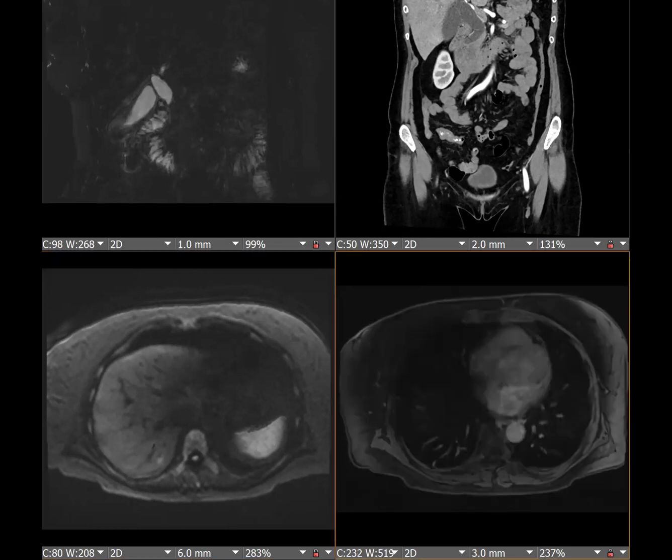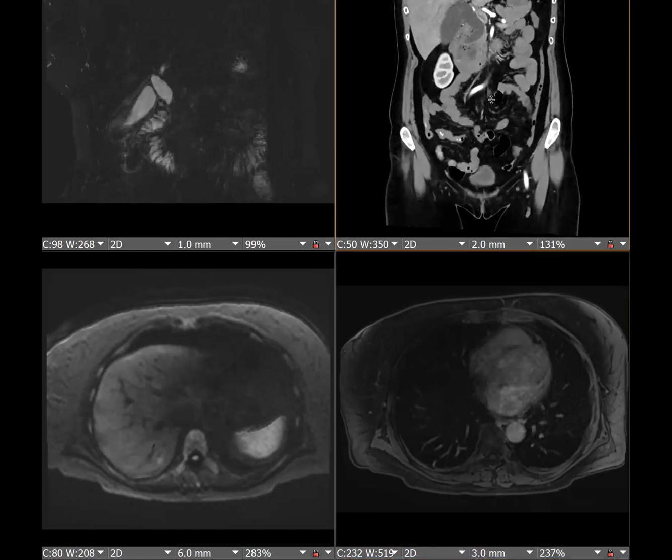So Ben, I don't know if you see the chat box, but Omar brought up Lemmel syndrome. That's actually on the CT, Lemmel syndrome was the diagnosis that was given, and this is the reason I'm sharing the case. Yeah, it's a bezoar in a diverticulum, and we had a case at Emory, so we love bringing up Lemmel syndrome. Yeah, but it's actually the first case of Lemmel syndrome that I was seeing.